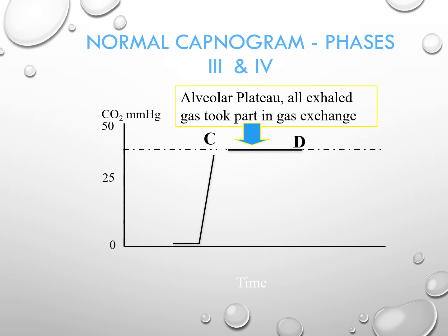Then looking a little further, you have your end-tidal value, and now the patient is inhaling, and you get this rapid drop. They're in between breaths, going down to a capnogram level of 0, and then you're ready to start this whole cycle yet again.